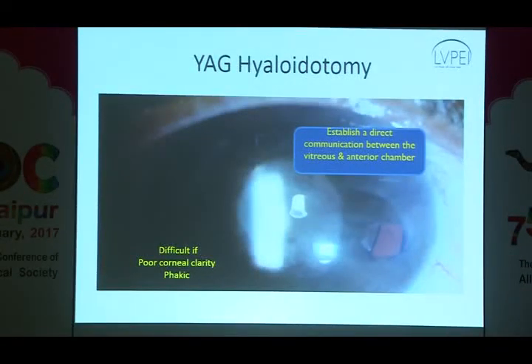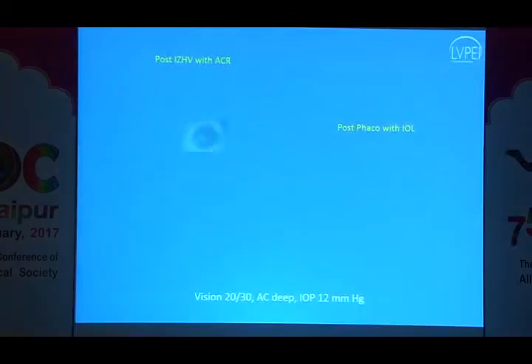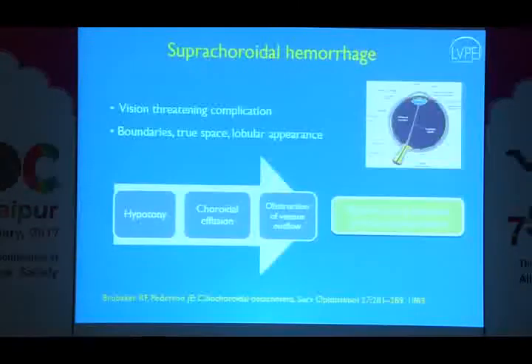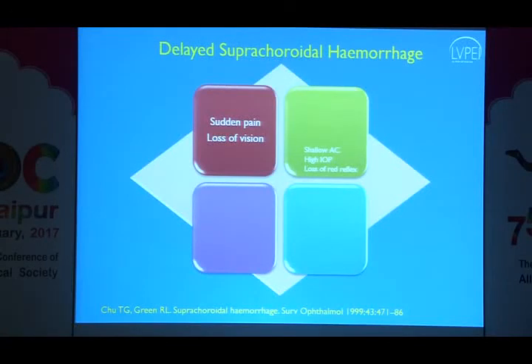In the presence of a malignant glaucoma, how we can manage it, there are multiple things, either it is medical or laser or a pars plana vitrectomy with an iridozonulo hyalodovitrectomy. And if you have a suprachoroidal hemorrhage, like I said, we have to be very, very careful. Sometimes this can happen intraoperatively also, but preoperative mannitol as well as reducing the intraocular pressure to a great extent in the preoperative period prevents this complication.